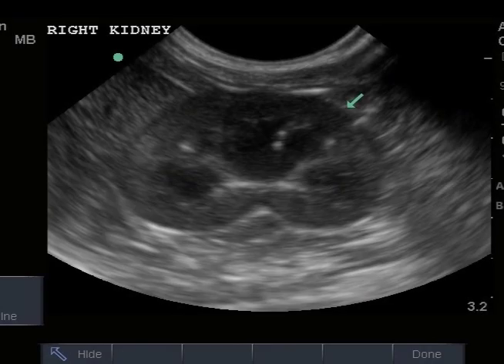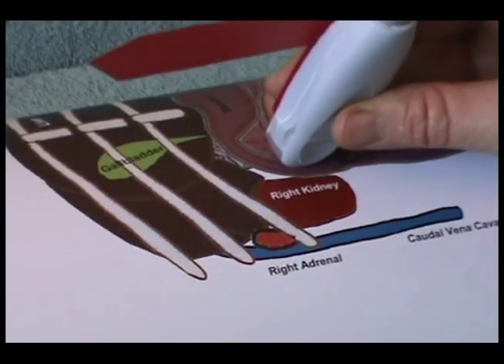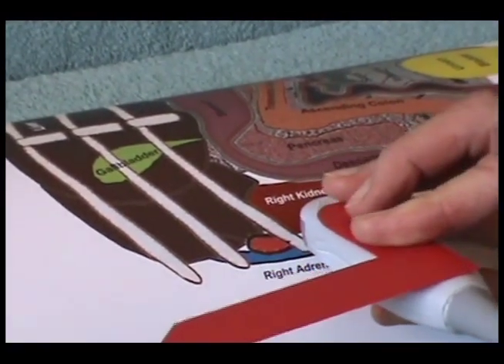Kidneys are encapsulated organs with 2 primary densities, a homogeneous cortex and a hypoechoic medulla. Once you reach the right kidney, go to a right lateral sagittal position to bisect the kidney.